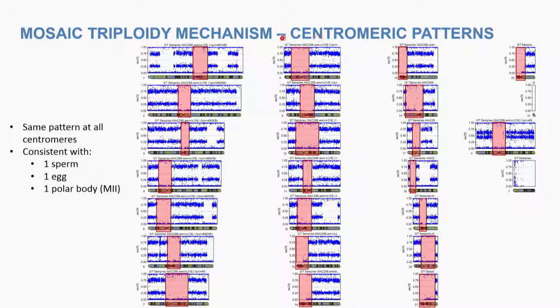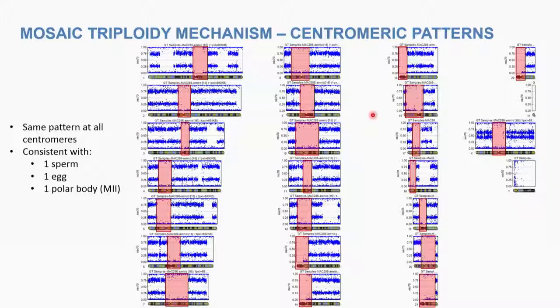Looking at only those informative genotypes and examining the centromeres (shown in red), every single centromere across the genome shows the exact same pattern — the extra genotype is never present at a centromere. That's not possible with two random sperm. This is actually consistent with one sperm, one egg, and one polar body from meiosis 2, where centromeres are always the same. A maternal genome was used to confirm two maternal contributions.